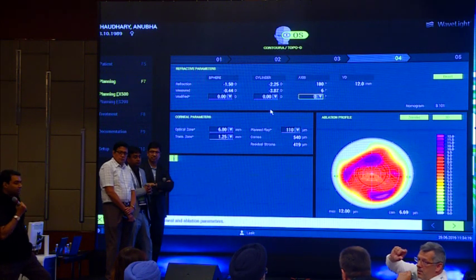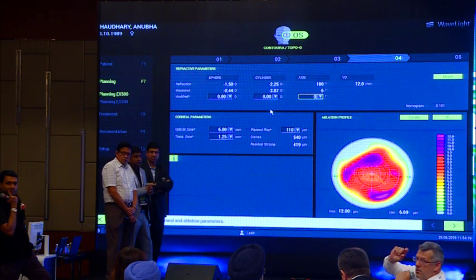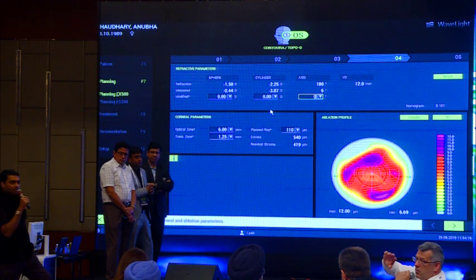And by the way, regarding the paper from Avi Wallenstein that you refer to, there's a little bit of stuff there to look at exactly what he did. He selected a certain group of patients. This is not the total group. It's 25 degrees to 160 and a certain amount of difference. And this is actually those patients that refer to group number 3. And yes, but what Dr. Praveen said is basically what the original FDA protocol was.